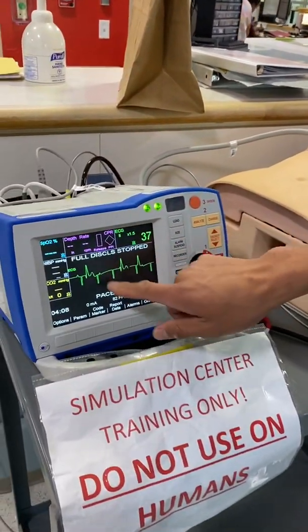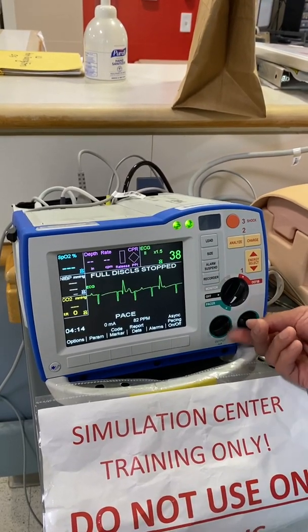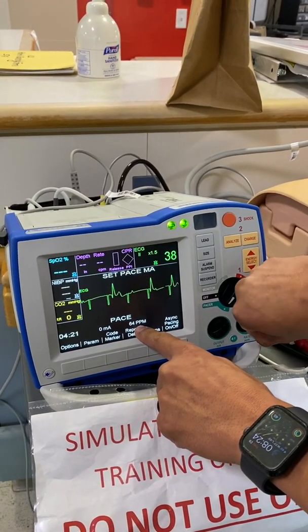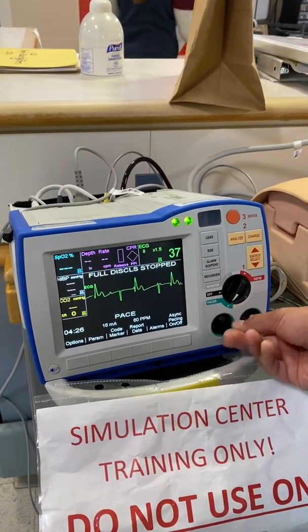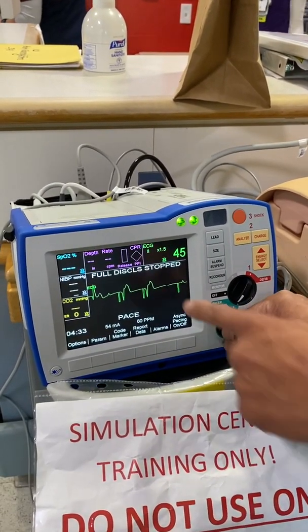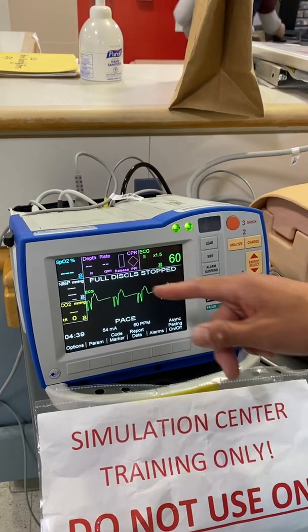I'm good to go. I'm seeing the rhythm. These are the pacer spikes — it automatically turns on. All I need to do is dial in my rate. I want to pace at a rate of 60, so I'm turning the dial and dropping it down to 60. Then I'm going up on my energy. I can go pretty quickly until I get capture. I'm watching for capture. I get capture. Now I want to find my threshold — the lowest amount of energy where I get pacer capture.